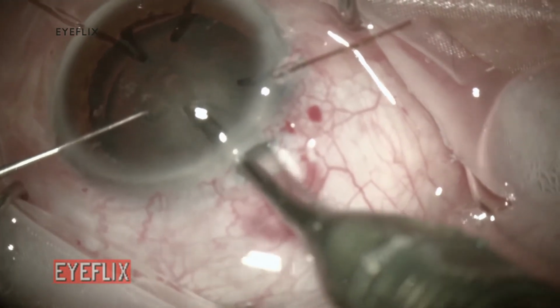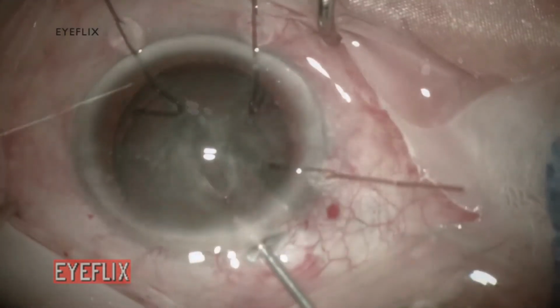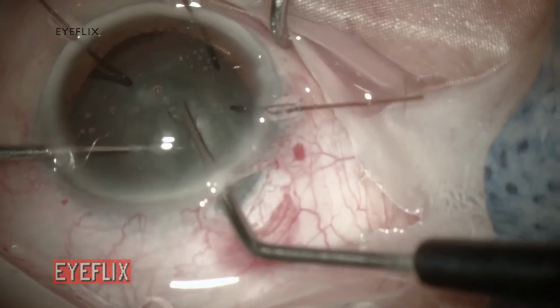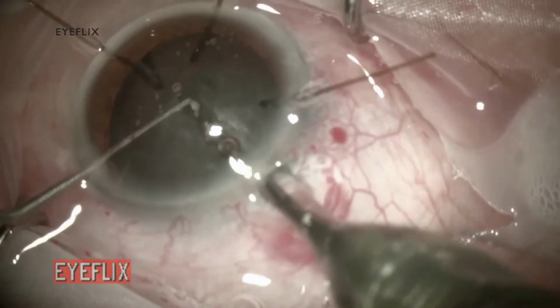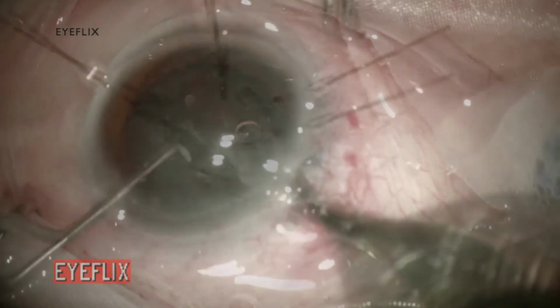I am now sculpting the groove for a stop and chop technique. A smooth and bimanual rotation of the nucleus to further deepen and elongate the groove. I am now cracking the nucleus in half and bringing one heminucleus up into the anterior chamber to chop it.